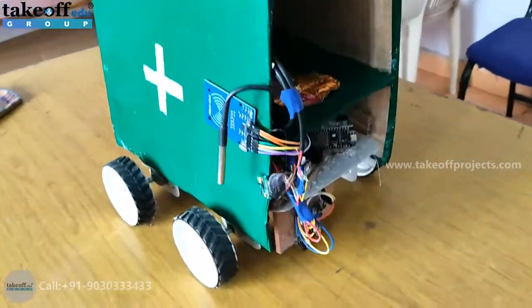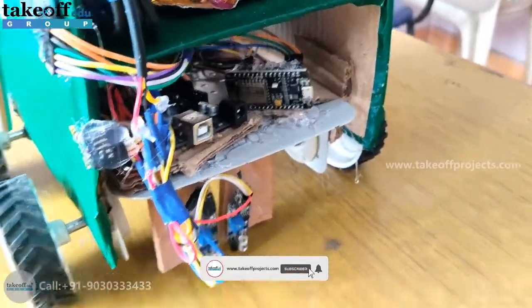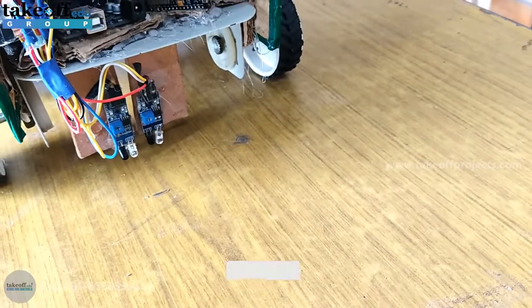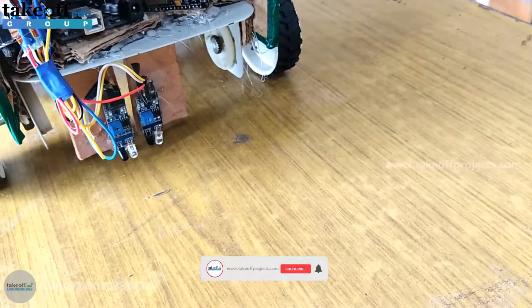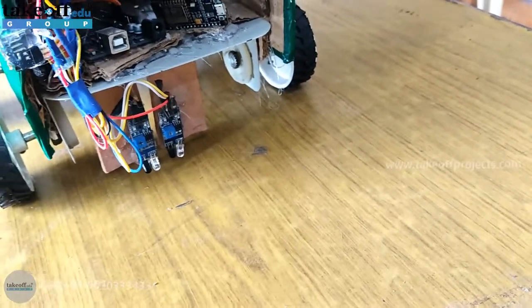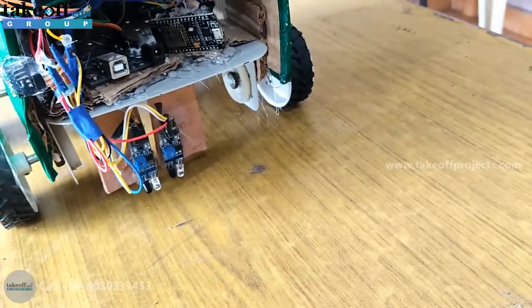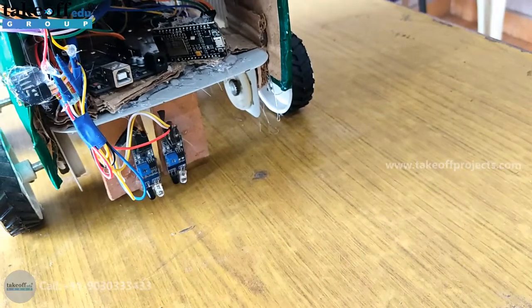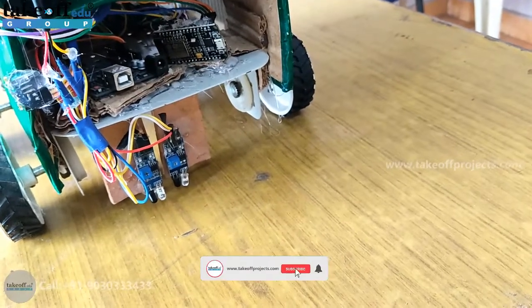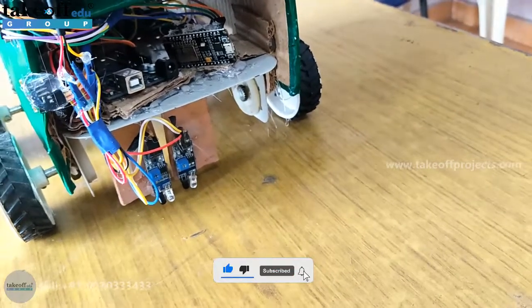With the help of this NodeMCU, it will upload the data to a cloud platform. The robot's movement depends on line following with the help of these two IR sensors. The IR sensors will detect the white path — if there is a white reflector on the ground, the robot moves forward, and if there is a black reflector meaning no reflection, the robot will stop. Left and right turns are taken according to IR sensor detection.